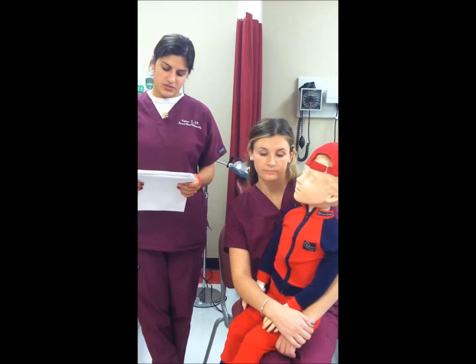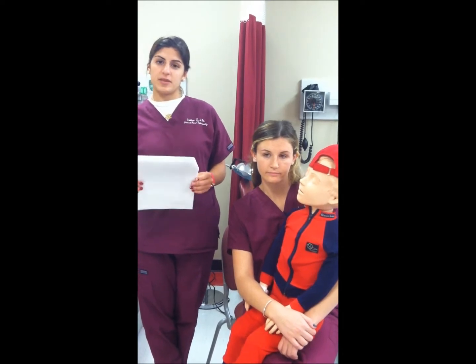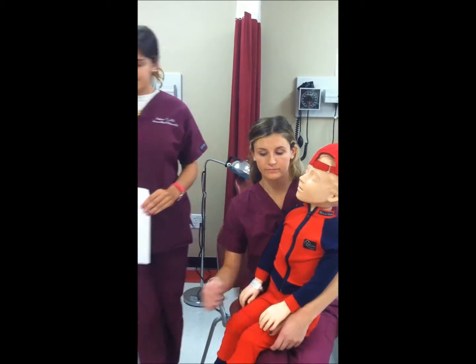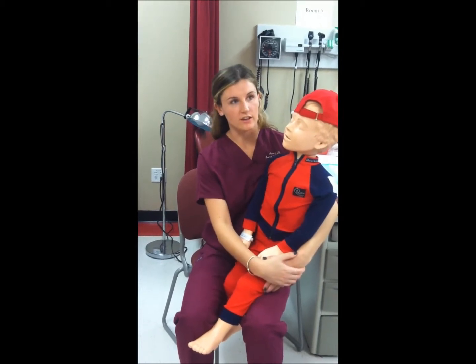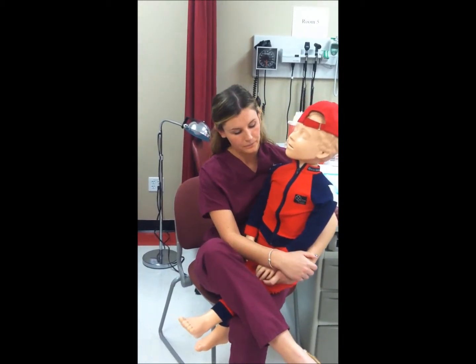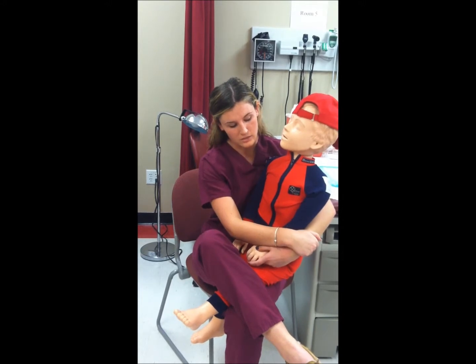An infant will have stranger anxiety, a preschooler will want to see their parent and fear pain. A school-aged child will be curious about their shot, and a teen will be uninvolved or disinterested. Therapeutic hugging provides atraumatic care for a child. You can position the child on the nurse or parent's lap and comfortably rest the child underneath your leg. Painlessly hold their arms and their legs so that the shot may be given and the injection will be atraumatic for the child.